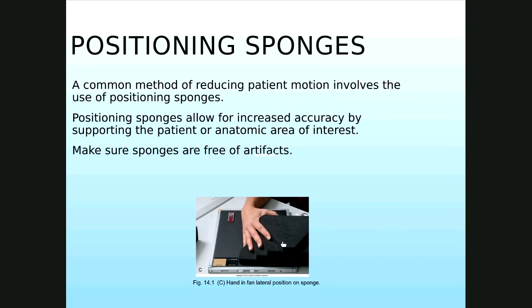This is porous material, so a lot of these are no longer in use, and you won't find them in the department because anything, blood, body fluids that is on that patient is going to be transferred to that sponge, and there's no way to clean it.